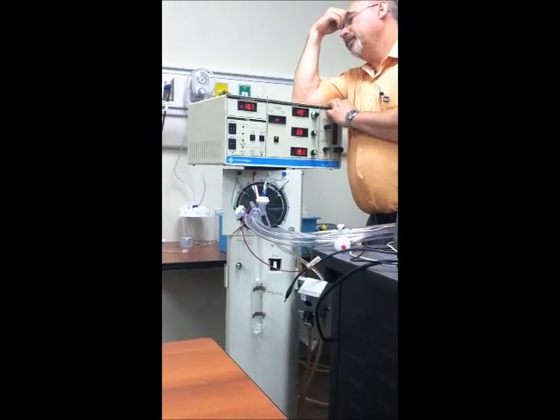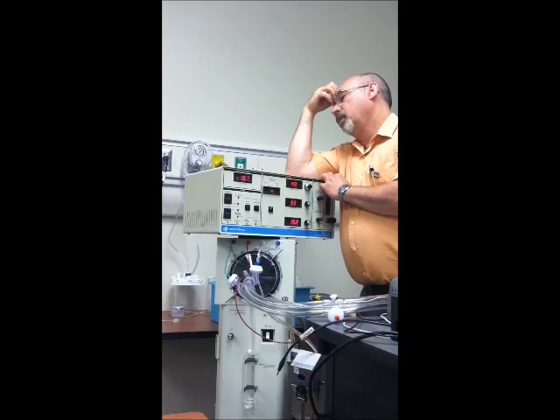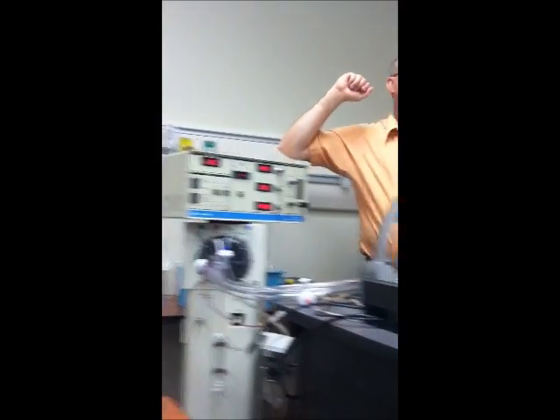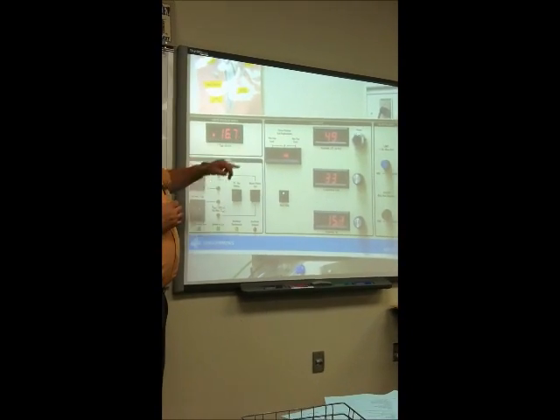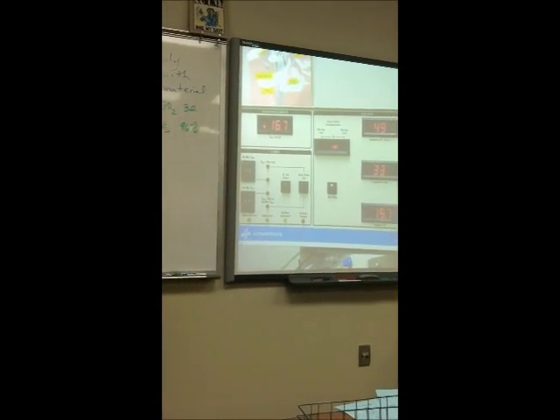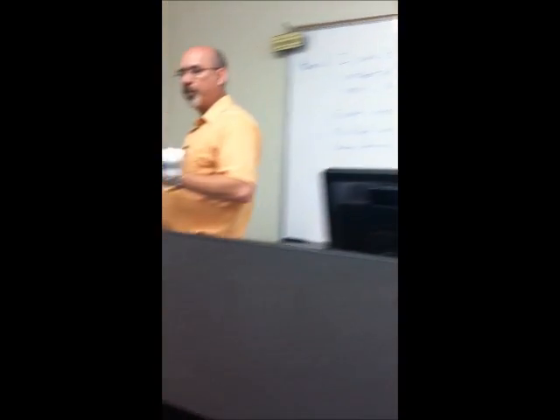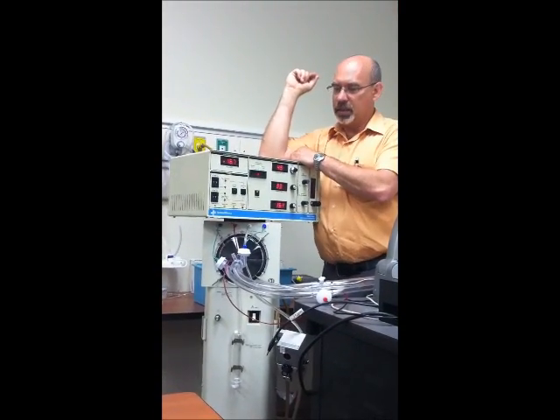Okay, and then observe. Was that supposed to be at delta P 6? It's at 4.9. This is supposed to be at 6. Oh. This is 49 centimeters of water. Okay. My issue is this should be a little bit higher. So I'm going to have to make sure there's not a tiny little leak in the circuit.